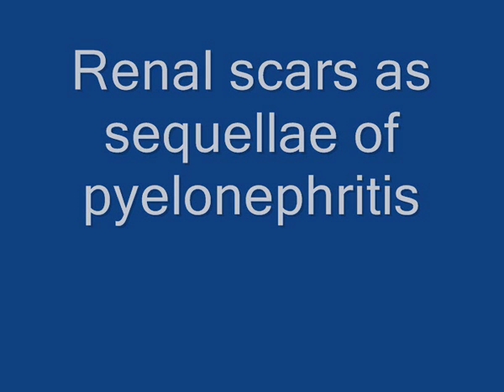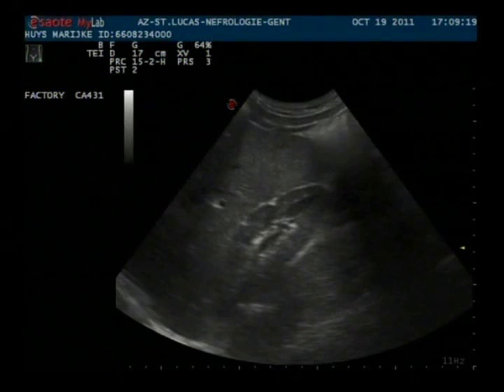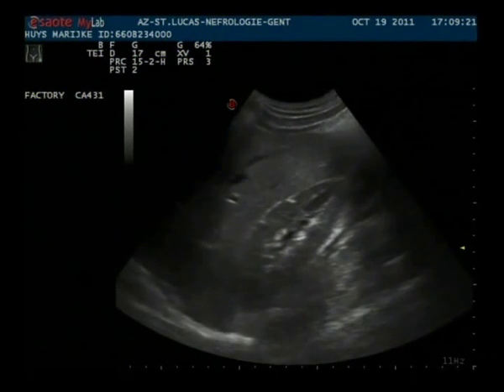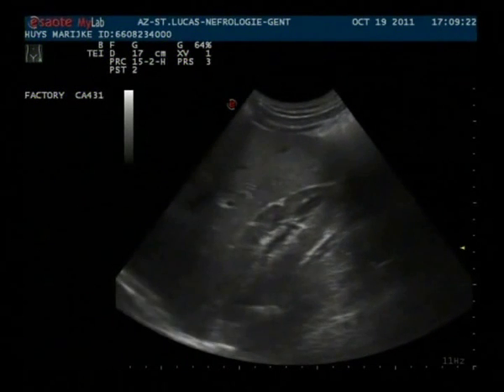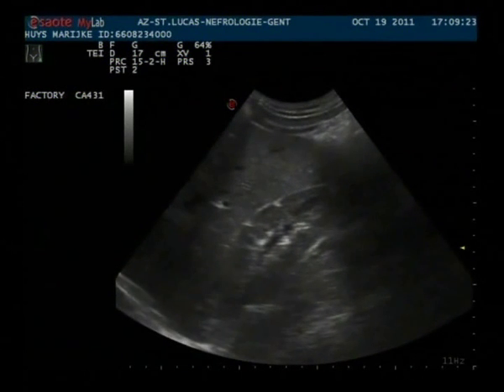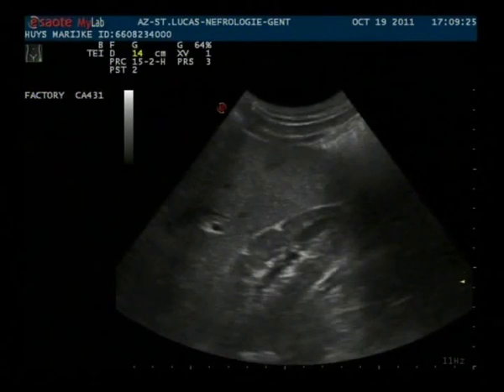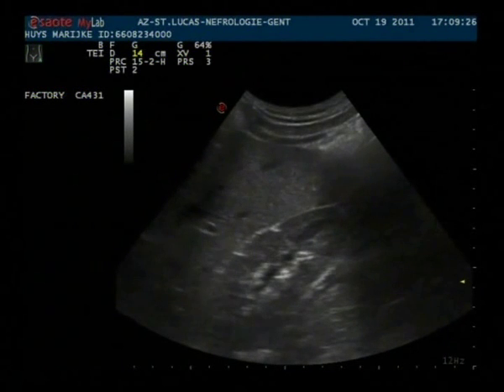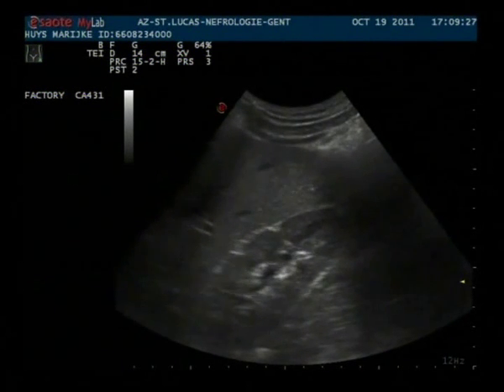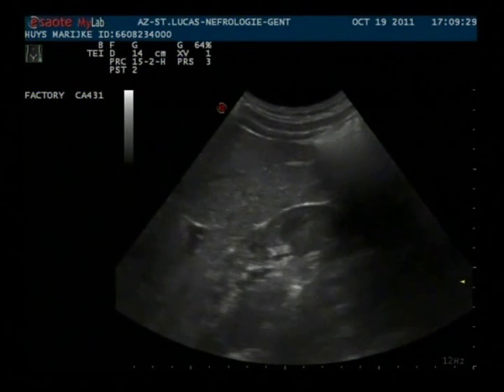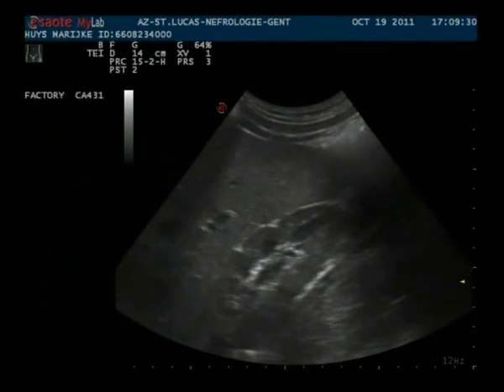Here we can see the right kidney of a 45-year-old woman who has repetitive episodes of pyelonephritis in her history.